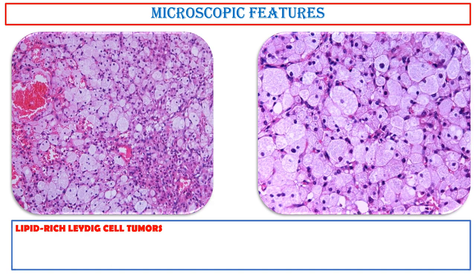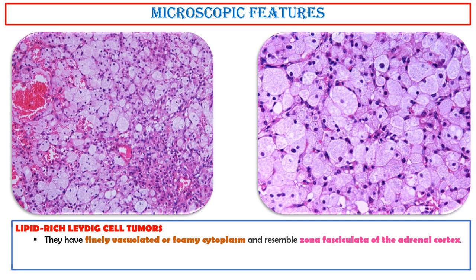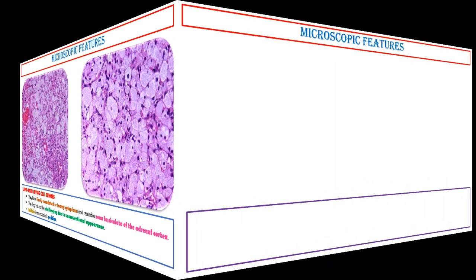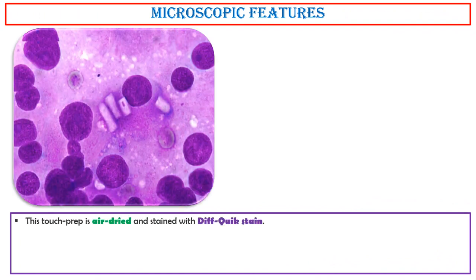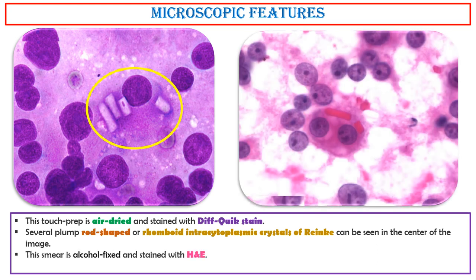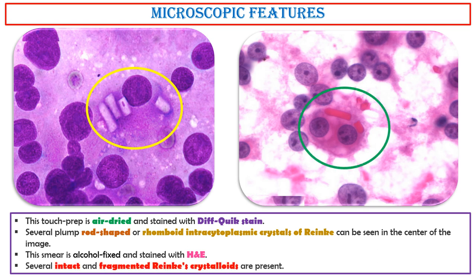Lipid-rich Leydig cell tumors have finely vacuolated or foamy cytoplasm and resemble the zona fasciculata of the adrenal cortex. The diagnosis can be challenging due to unconventional appearance. Inhibin immunostain is positive. This touch prep is air-dried and stained with Diff-Quik stain. Several plump, rod-shaped, or rhomboid intracytoplasmic crystals of Reinke can be seen in the center of the image. This smear is alcohol-fixed and stained with H&E; several intact and fragmented Reinke crystalloids are present.